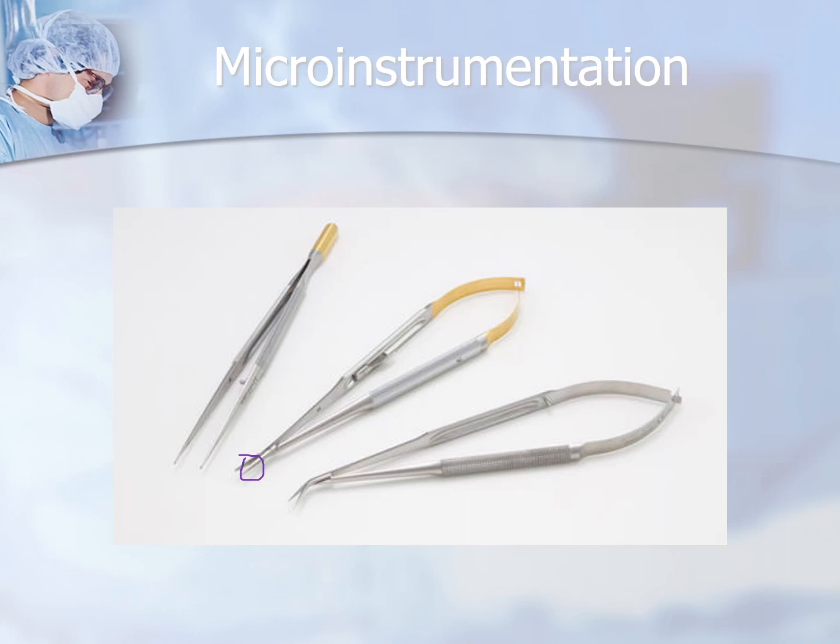And you can see how they have the satin finish. So when they're working under that light of the microscope, there's not a blinding reflection going on there.